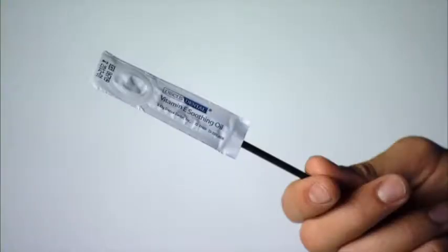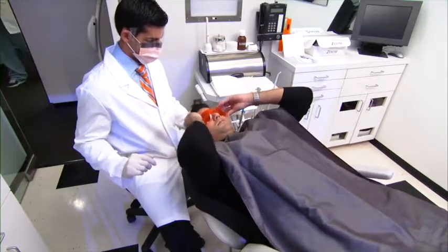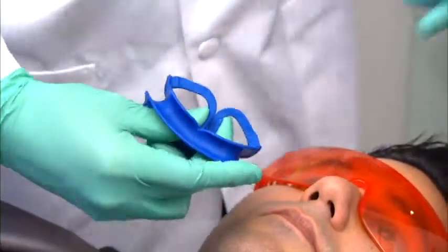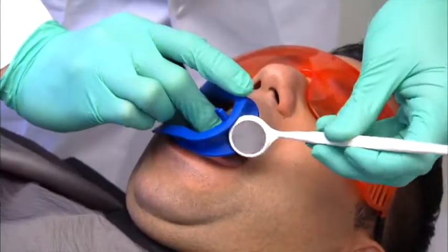Apply vitamin E to the patient's lips to moisturize before retraction. Then fully recline the patient and place their protective eyewear. Adjust the eyewear for proper fit and comfort around the ears. Insert the IsoPrep retractor at an angle, retracting one side at a time using a dental mirror to assist in placement.